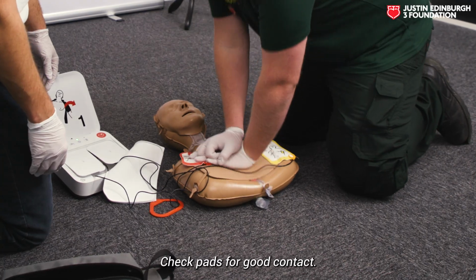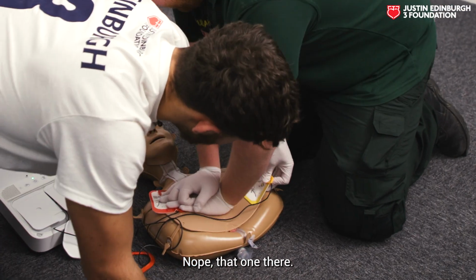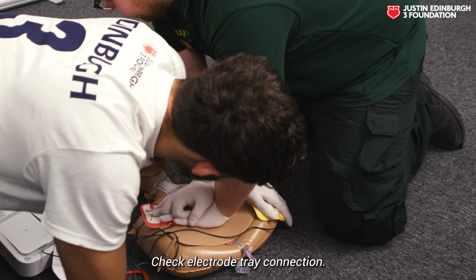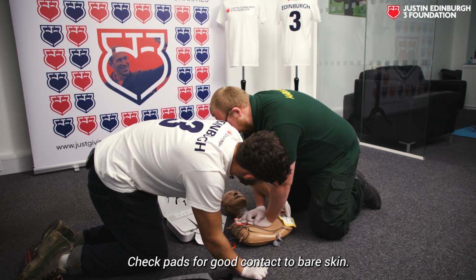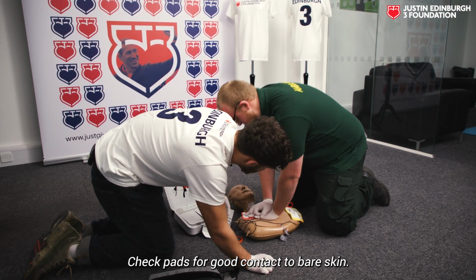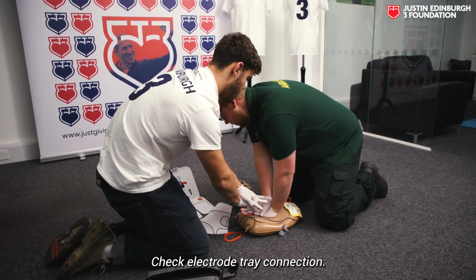Check pads for good contact to bare skin. So that pad wants to come a little bit further down. Nope. That one there. Check electrode tray connection. Is that right? Check pads for good contact to bare skin. Check electrode tray connection. If you take over chest compressions, right on.